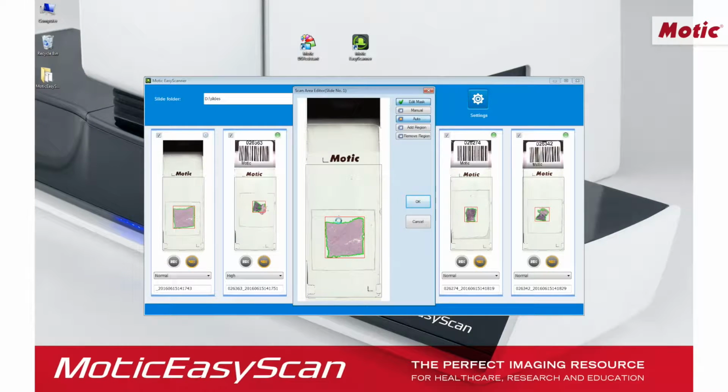Moreover, the blank areas are identified and discarded in order to shorten the scanning time. Nevertheless, a manual edition is always possible to customize each one of the slides. I can also add some regions to my previous selection, or I can remove a part of the selected region.